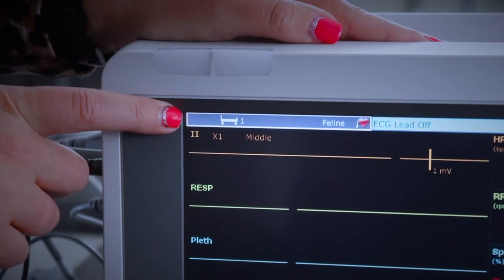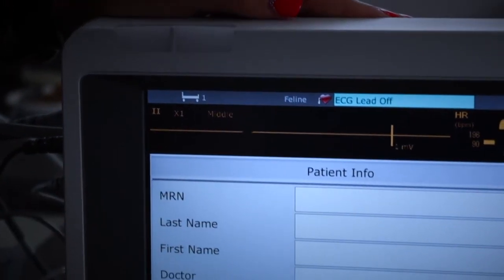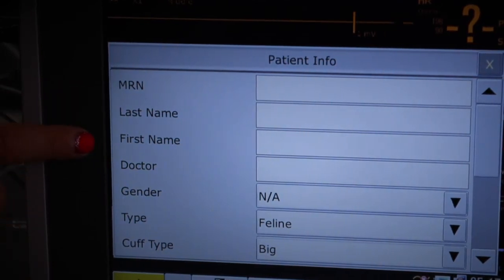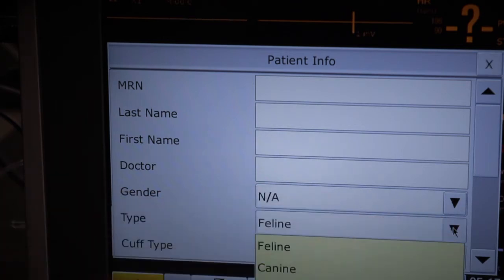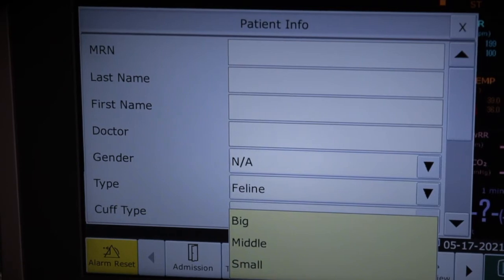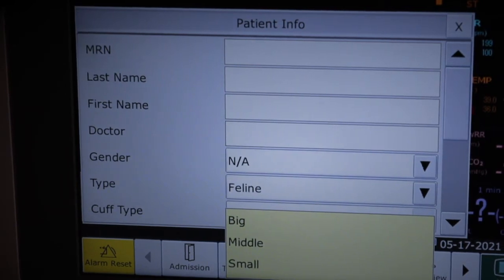At the top of the screen there is an icon that looks like a trolley or small bed — click that to admit your patient. MRN is your patient number from the practice management system; you can enter it or not. Last name and first name are optional. The two most important fields are type and cuff type. Under type, select feline or canine. Under cuff type, select the correct sizing: big is the red cuff, small is the orange one, and the three in the middle — blue, green, and turquoise — are all classed as middle.